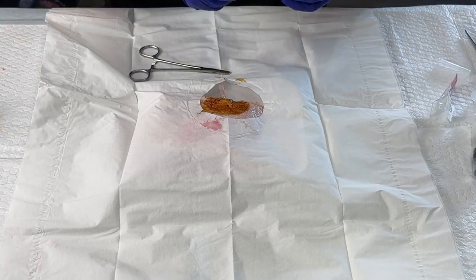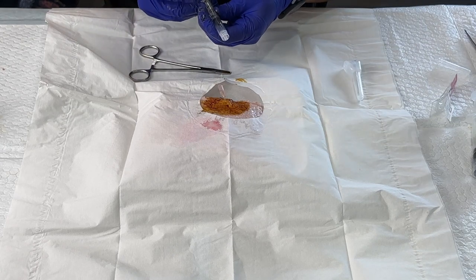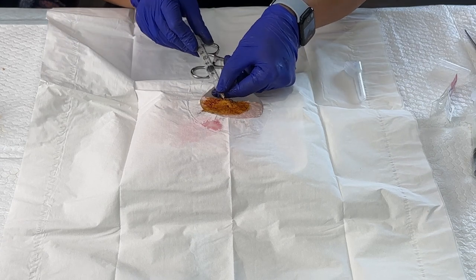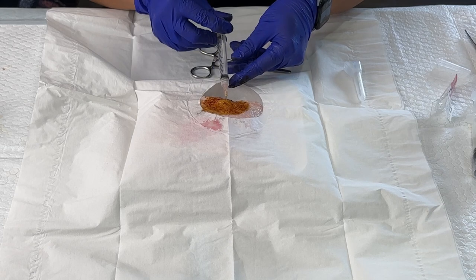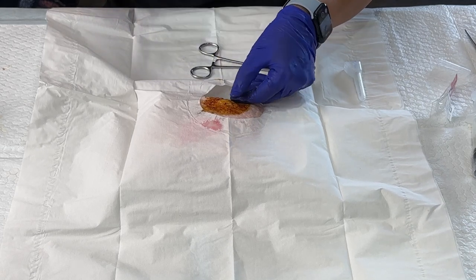then you could hold it in place, attach it on there, and then inject the steroid and then remove the needle.